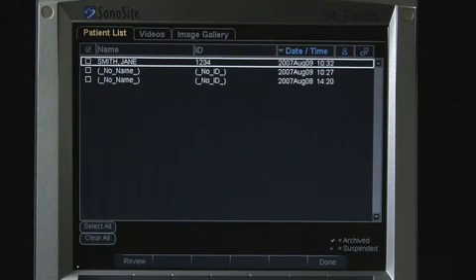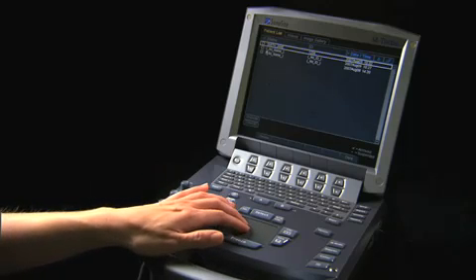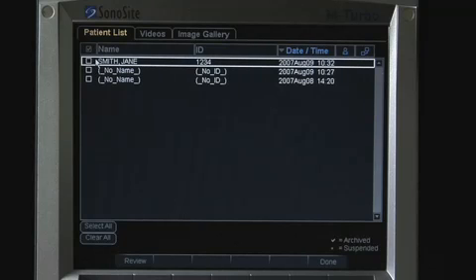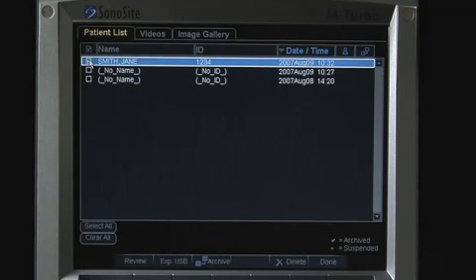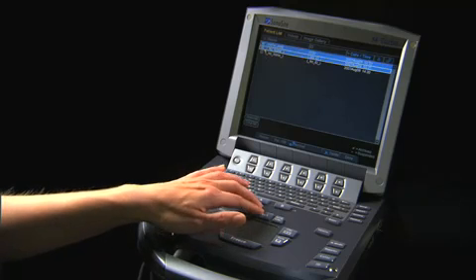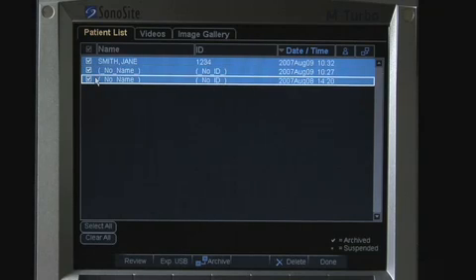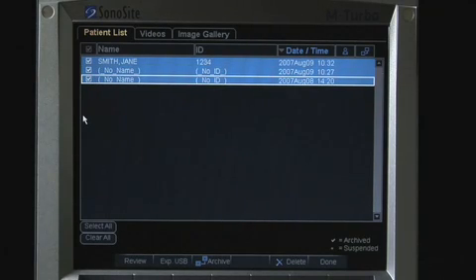To select a patient exam to archive, check the box on the left. To choose additional patients, just scroll down and select each exam. Notice each patient exam has a check mark to indicate it is included.